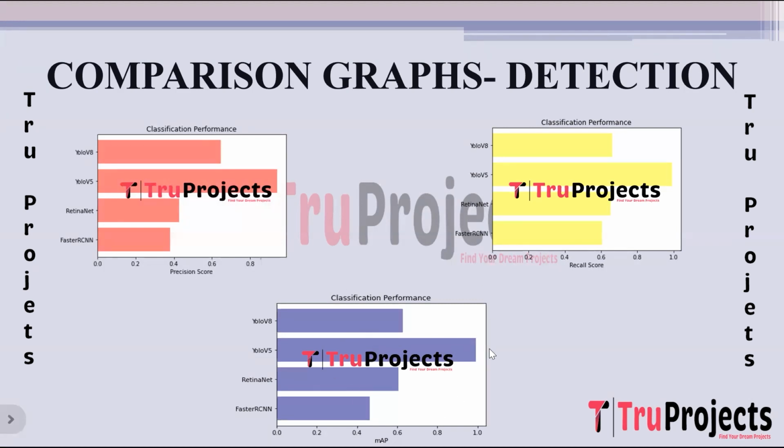This is the MAP comparison graph. On the x-axis we have MAP and on the y-axis we have algorithm name. MAP, mean average precision, is a commonly used metric in object detection tasks like identifying cancerous regions in medical images. It calculates the average precision for each class, in this case cancerous regions in lung images, and then averages those precision across all classes. It considers both precision and recall at various thresholds to provide a single scalar value that represents the overall performance of the model.